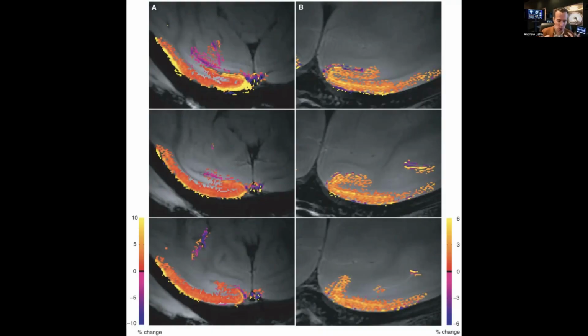So gradient echo, and the physicists in the room, throw me some rope if I'm maybe confusing some of these topics, but gradient echo will allow for much quicker TRs and TEs. So in general, this can be used for accelerated neuroimaging, but again, can be much more sensitive to field inhomogeneities.